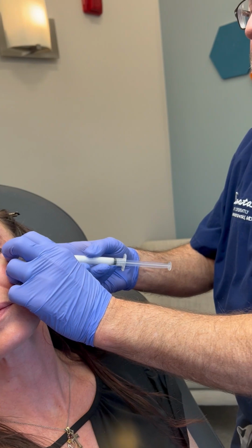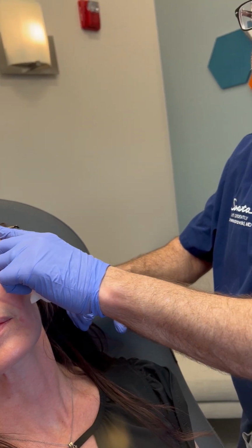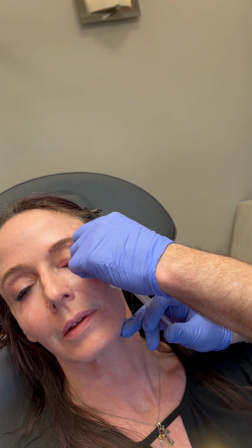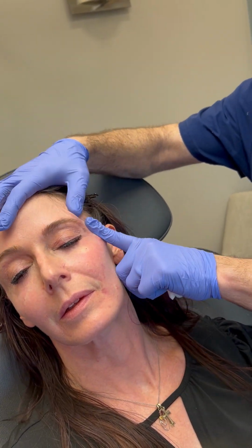And again, I said 1.5, but it's actually a 2 inch cannula, because this is one of those areas where you want to reach all the way up to the temporal fusion line, which is up here. You'll need a slightly longer cannula to do that. And again, we're staying superficial. There's a lot of vessels here, so we want to use a cannula, and then we'll just put that in, and we can do, let's say, 2.5.